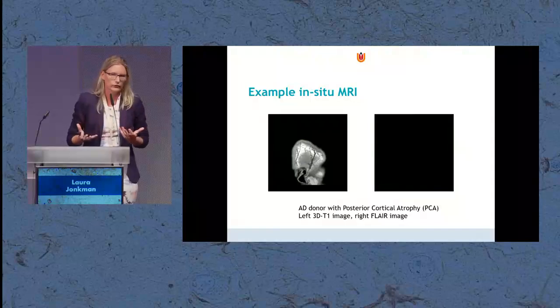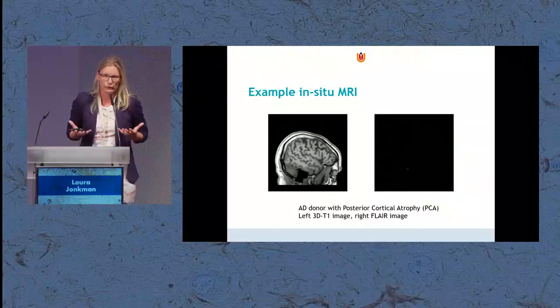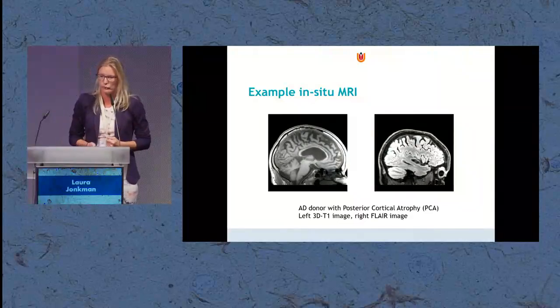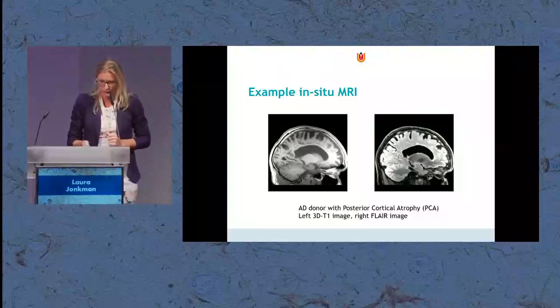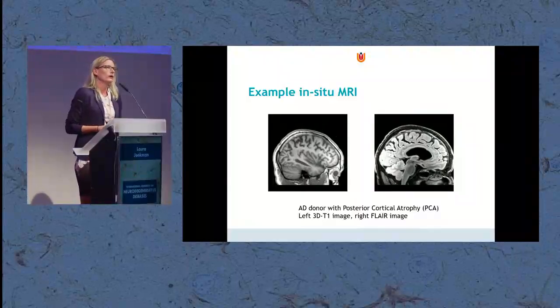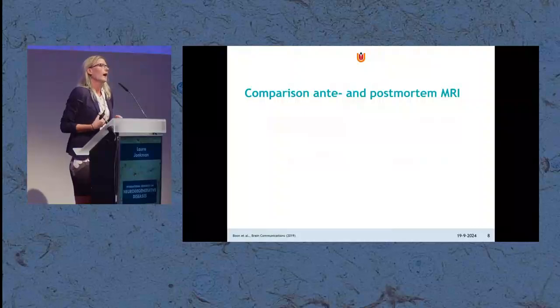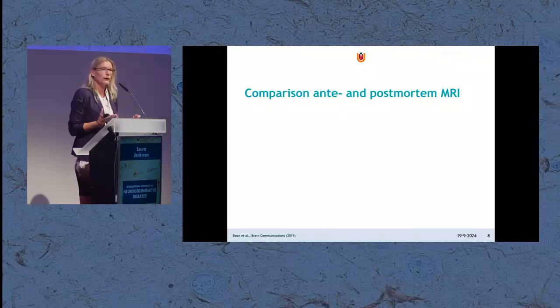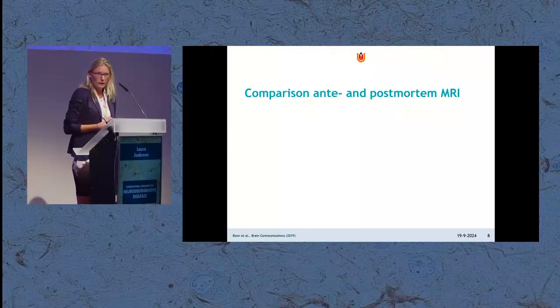But the message here is that it looks on first sight very similar to an in vivo MRI made during life, with maybe a bit more atrophy. That was also a question we had in mind: how comparable are these post-mortem MRIs? I can tell you that they're very comparable, almost similar to the in vivo situation, only a few hours later. But of course you would ask, well, just show us.